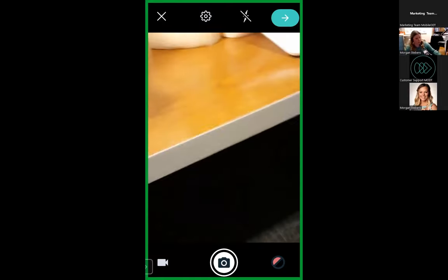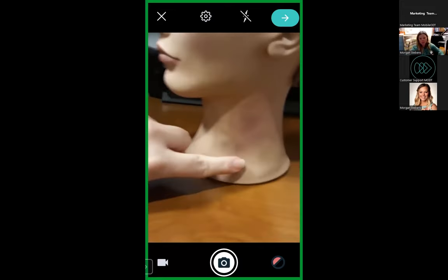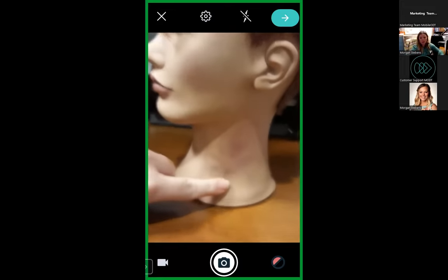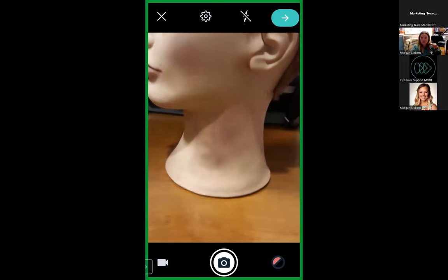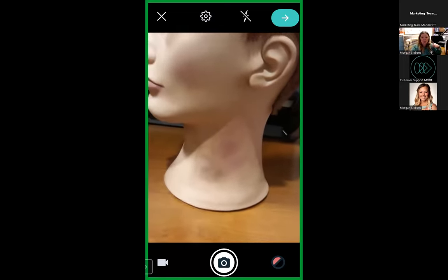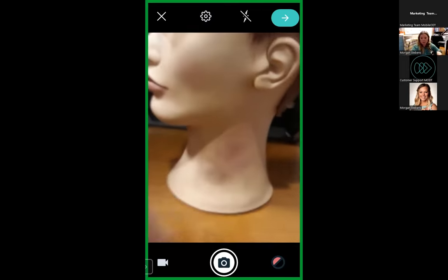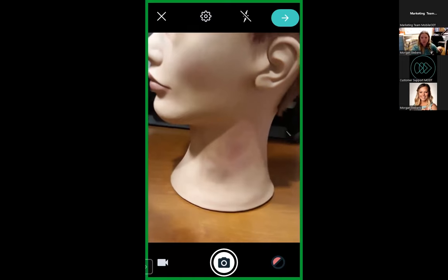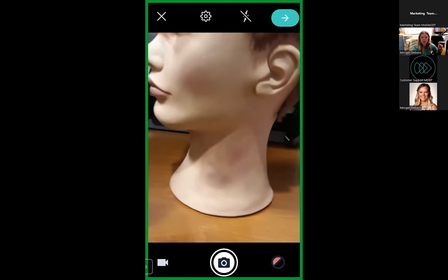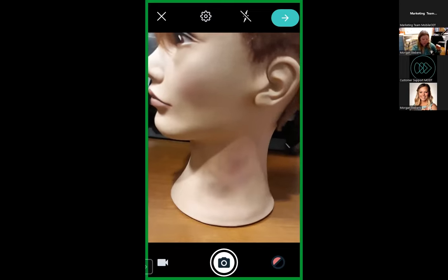And so in terms of taking photos for a strangulation, we know that this probably isn't what it's going to look like. We know that it's probably going to look like those really light or faint bruises that you saw on my daughter's arm. If there's anything, maybe some redness, but you notice that if you switch your light up, if you turn your flash on, turn your flash off, use that high contrast filter, you can really see that injury in different ways.